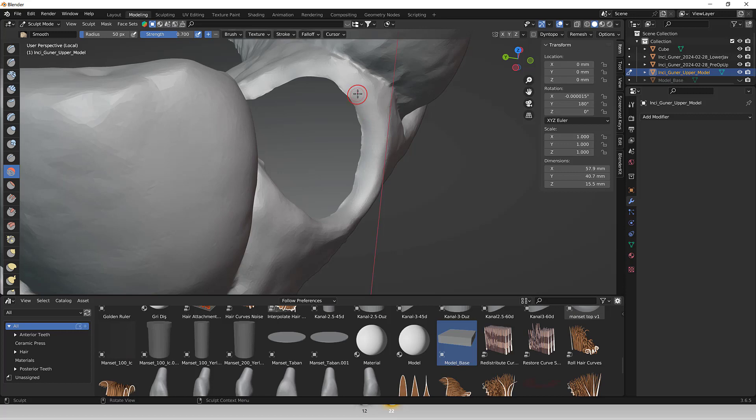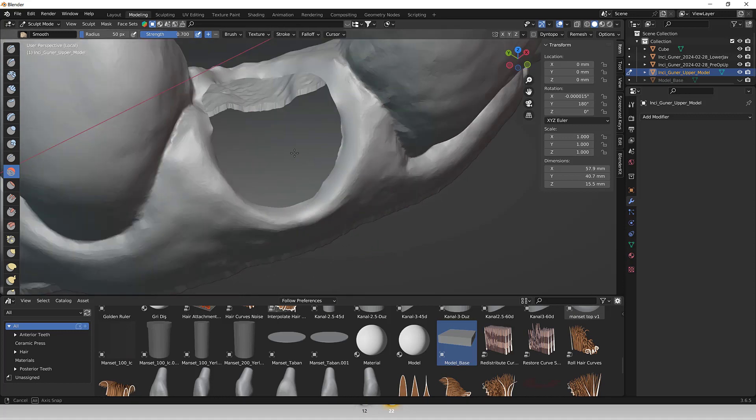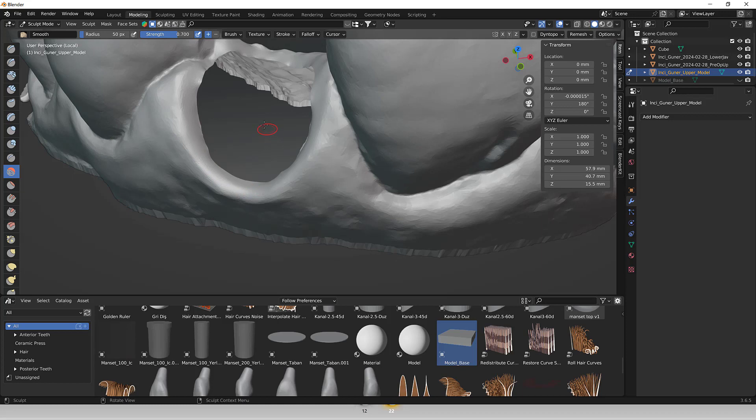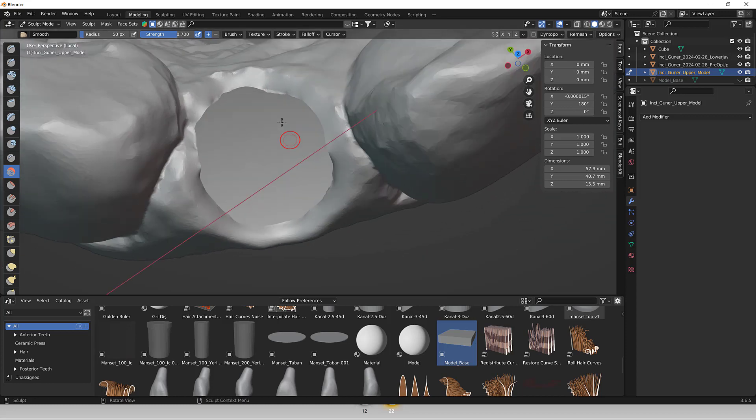Blender is a powerful and versatile 3D modeling software capable of handling various tasks, including editing, sculpting, and rendering. It provides a wide range of tools and features suitable for modifying STL files to meet specific dental requirements.